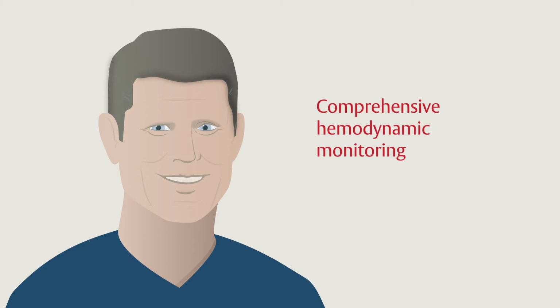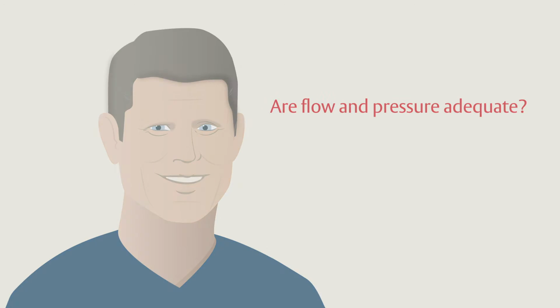Hemodynamic monitoring involves evaluating the components of blood flow. As clinicians, we're trying to determine if low flow or pressure is limiting oxygen delivery to vital organs. Traditionally, hemodynamic monitoring was accomplished by simply measuring heart rate and blood pressure.